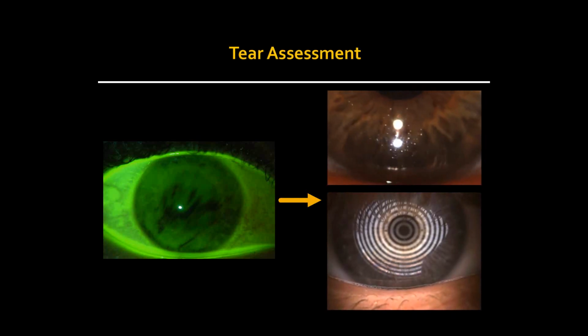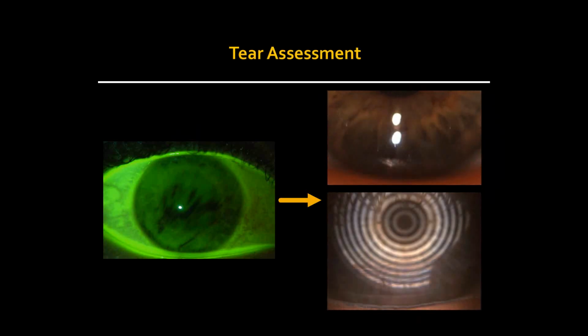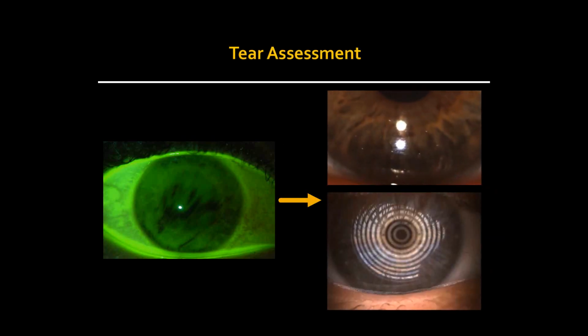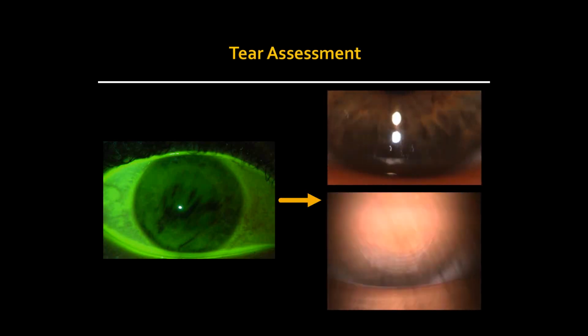Traditionally, yes, you can do that from behind the slit lamp. You can also use instrumentation to measure the viscosity of the tear. You can see in that upper video, with each blink, the time it takes for that inherent tear debris to move across the surface.